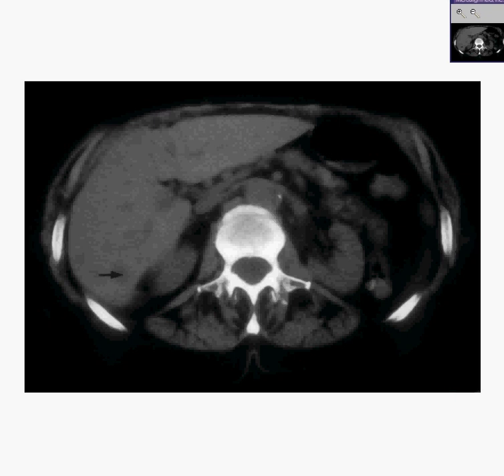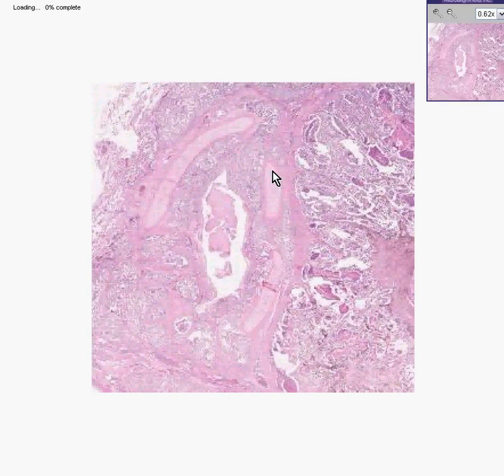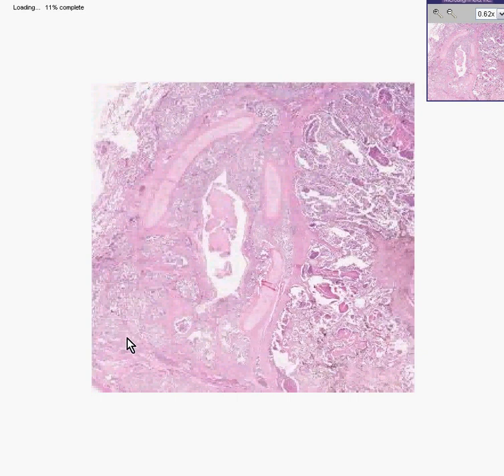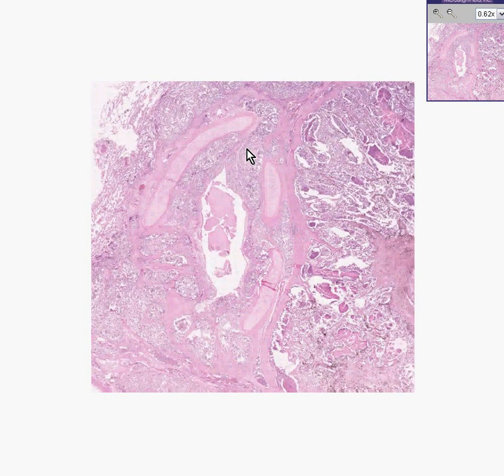Let's look at some slides now. Here is a slide of a lung from that same patient. You could see some bronchial cartilage. You could see some generally compressed or infiltrated lung — it might be worse along here than it is here. There may be a relatively normal lung here, but there is definitely something seriously wrong with the lung. The bronchial integrity also appears to be invaded by something.